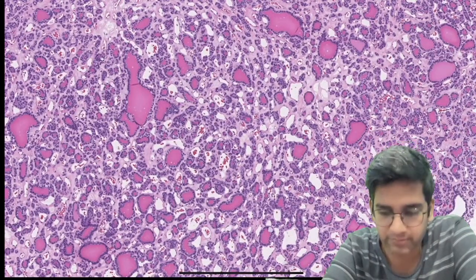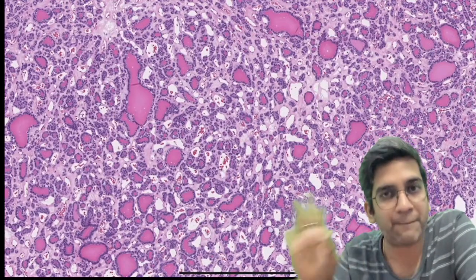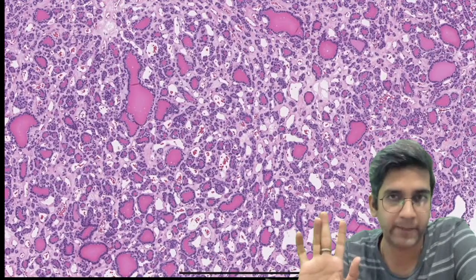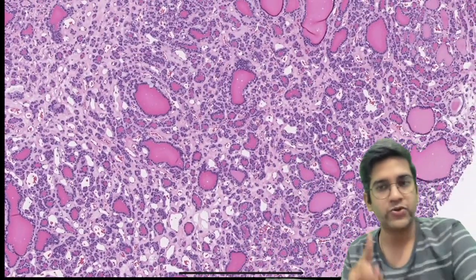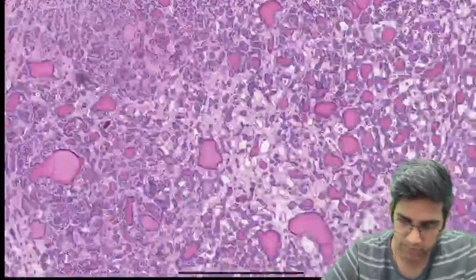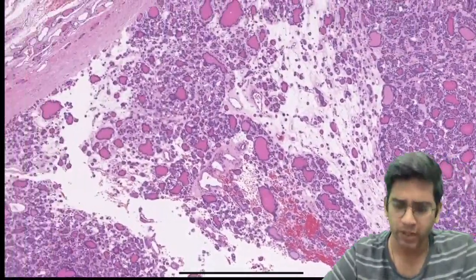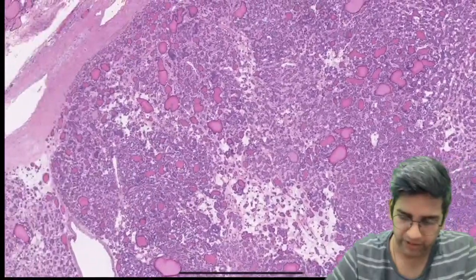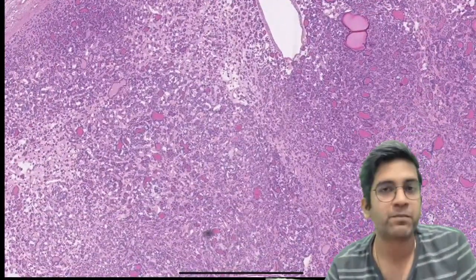Okay, perfect. Next, will you also accept that I am having follicular pattern of thyroid neoplasm? Not difficult to identify. See, when I say follicular pattern, remember macrofollicle, microfollicle, fetal-like follicle, everything goes to follicular pattern only. I do have good big follicles, I do have small follicles also, right? So second point is also done. Do I have any papillary network anywhere or any psammoma bodies anywhere? See, because the patterns can be appreciated only on low power microscopy, nuclear features can be appreciated only on high power microscopy, right? Perfect. I don't have anything. It's predominantly follicular area, no papillae, no psammoma bodies.